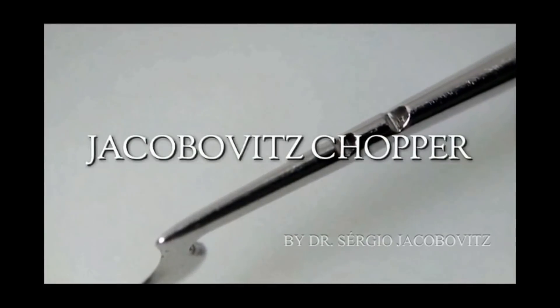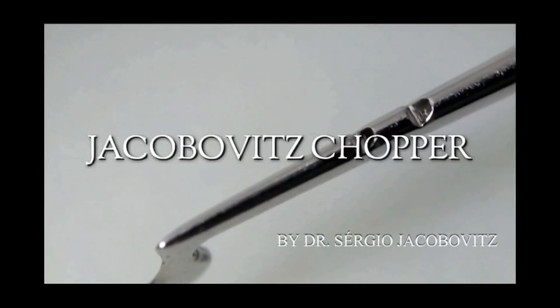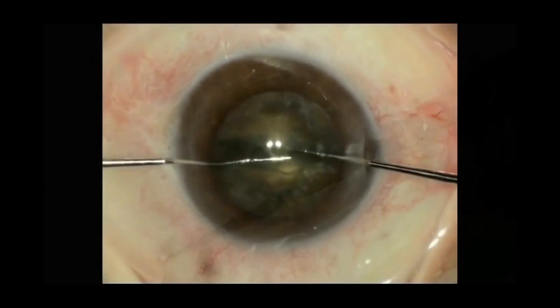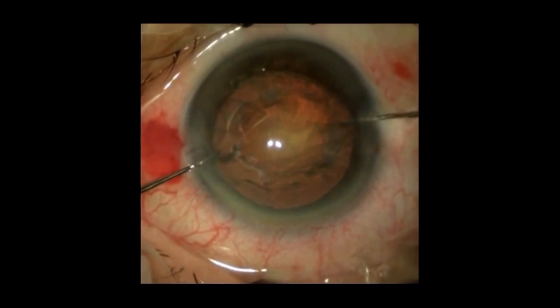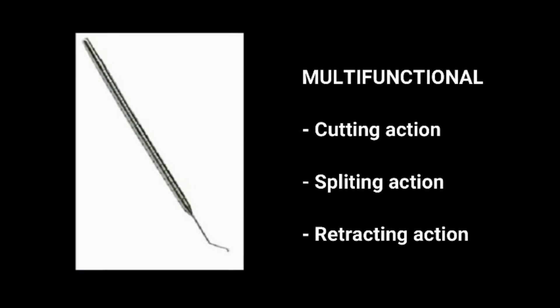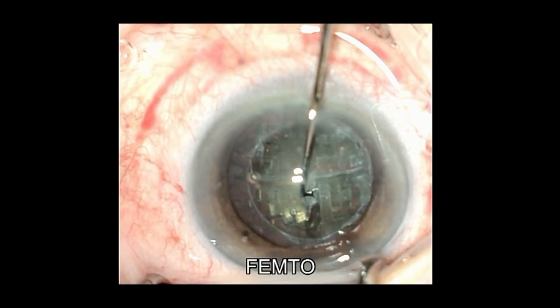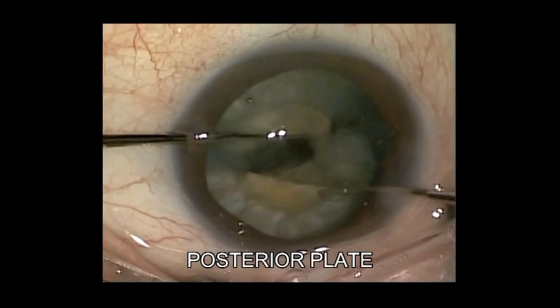Hi, this is Dr. Sergio Jacobovitz, and in this video I would like to present you a new instrument for cataract surgery. Jacobovitz Chopper is a new multifunctional tool, used for virtually all grades of cataracts, and suits for various techniques according to surgeon's preference.